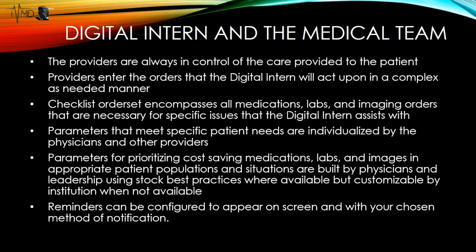Key tenets of the Digital Intern are that the providers are always in control of the targets and options available to the patients. Providers enter Digital Intern order sets for the Digital Intern to act upon, as the Digital Intern does not write its own orders. The order sets function as a checklist, and parameters are set to meet specific patient needs, but defaults are available to use in common circumstances, with the Digital Intern working within the electronic medical record to minimize changes to workflow.